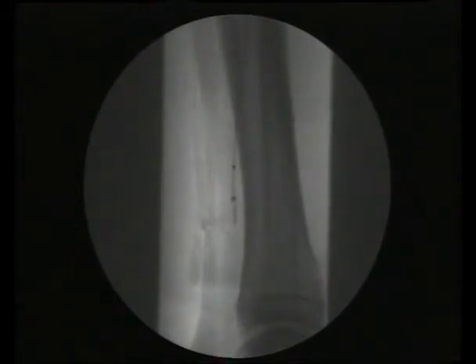Now that the resistance has been eliminated, the balloon has progressed forward. We start moving the loop forward gently and a small amount of contrast is used to confirm the intraluminal position. We get the loop back in again, and it is very important that the loop is maintained particularly at the ankle level so as to negotiate the bend into the distal anterior tibial artery. The loop is maintained short so as not to cause a perforation at this level.